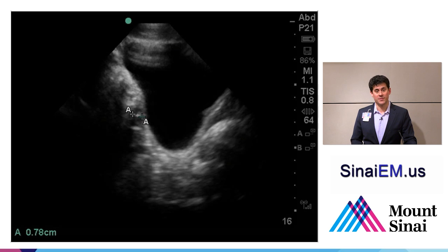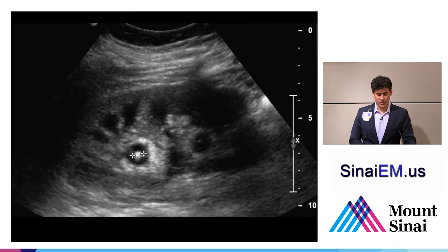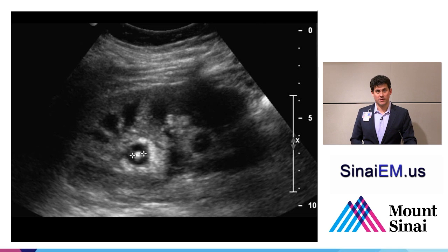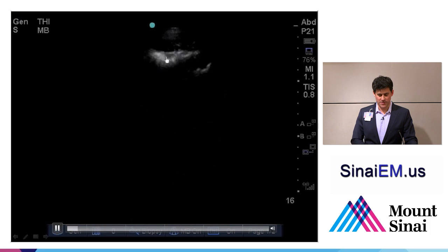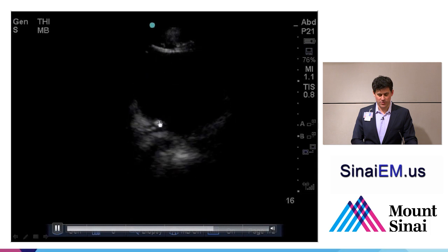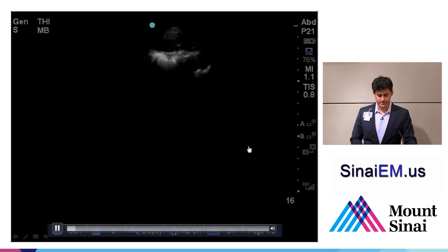Typically the places you'll find stones are in the renal parenchyma itself, trapped at an area like the UVJ, or floating inside the bladder. Here we see a stone in the renal parenchyma itself. Don't be misled clinically — many people have renal parenchymal stones and are asymptomatic. Be cautious about attributing all symptoms to renal colic just because there's a stone in the kidney, as a broader differential should be considered without other evidence of obstruction.